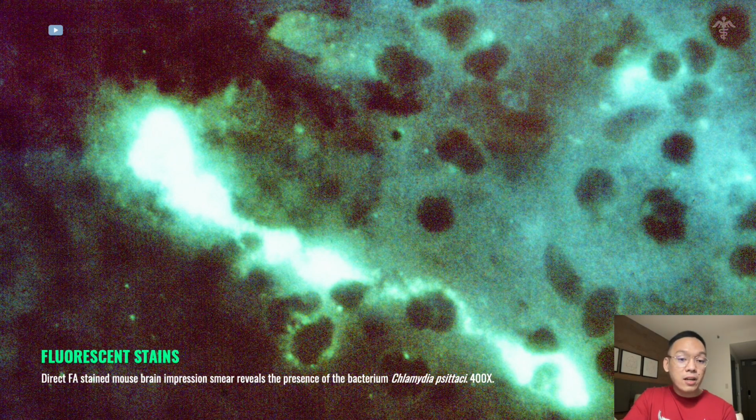The sensitivity of this test, direct FA, is determined by the number of organisms present in the test sample and the quality of the antibodies used in the reagents.